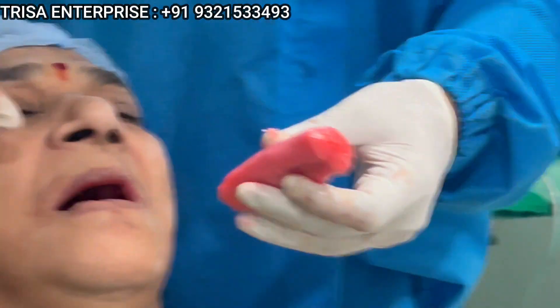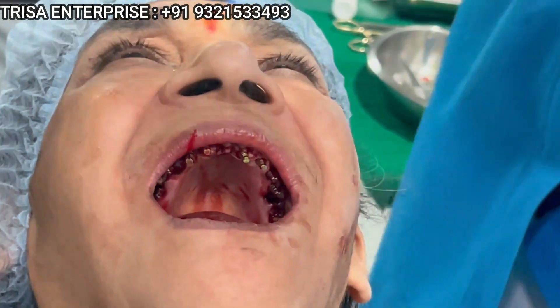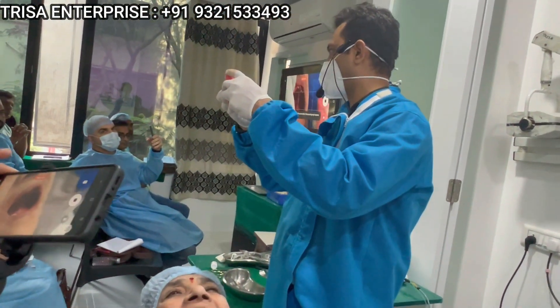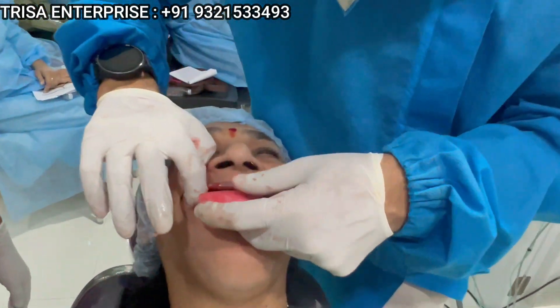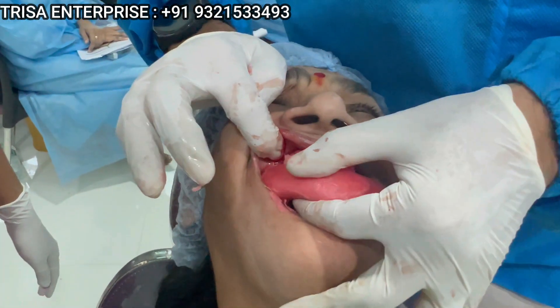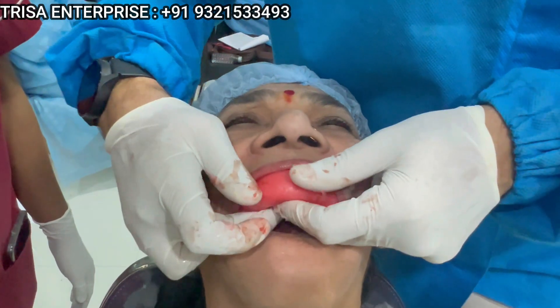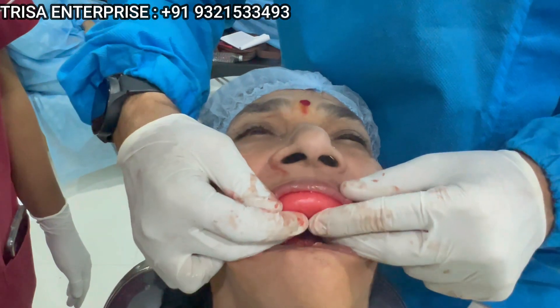You take this and place it in the mouth — while placing it, all your implants penetrate in the center of this. Just see how I'm doing it. Now the rim — you control it and mold it buccally and lingually.